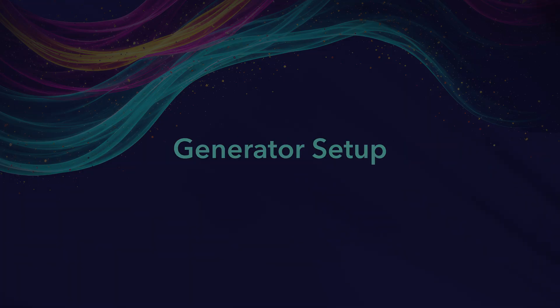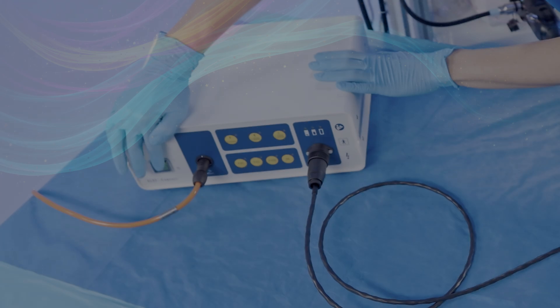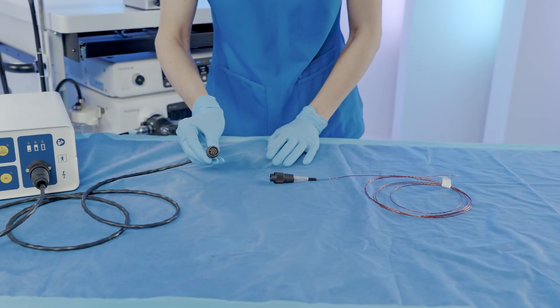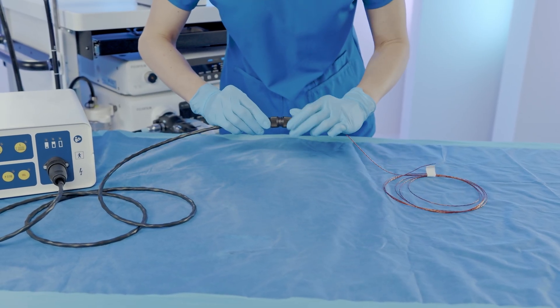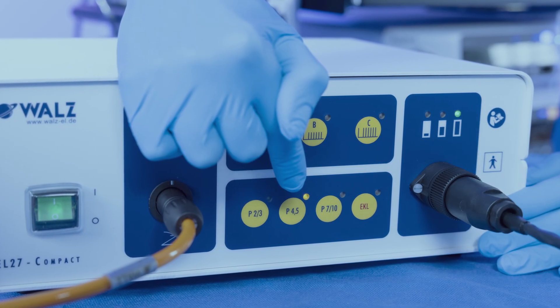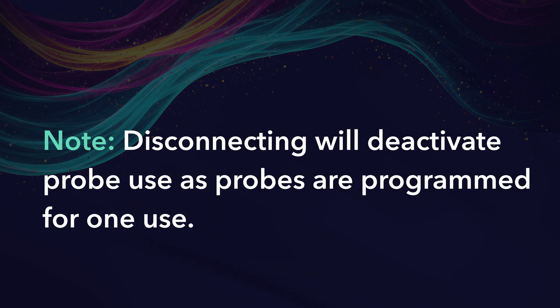Electrohydraulic Lithotripsy. Generator setup. Plug in the power cord, probe connector cable, and foot pedal for the Waltz EHL. Turn on the generator. After ensuring the physician will be using an EHL probe, attach the desired probe — 3.0 or 4.5 French — to the connector on the generator face. The generator will auto-recognize the probe and the corresponding probe indicator light will start to blink. Insert the probe down the DPS working channel first, then push the button to confirm the probe size. Disconnecting will deactivate probe use as probes are programmed for one use.